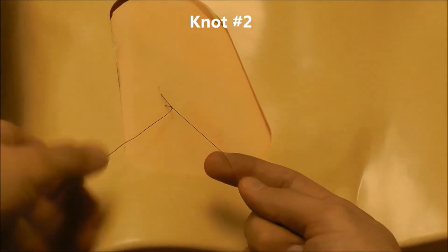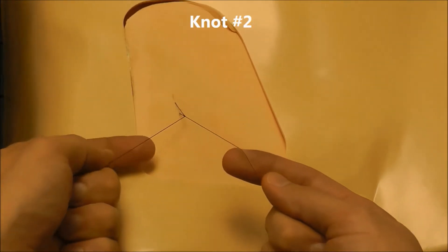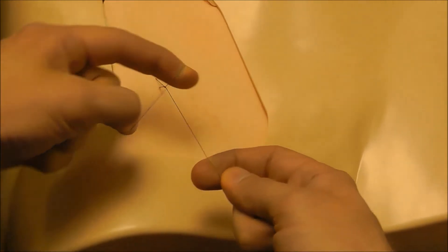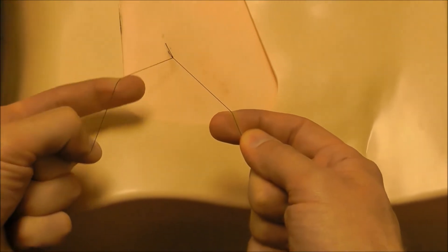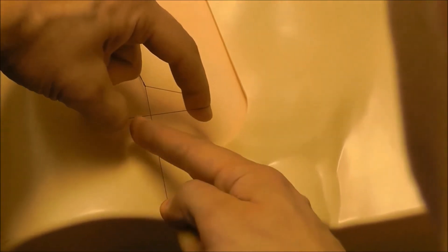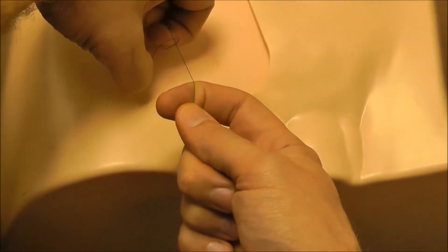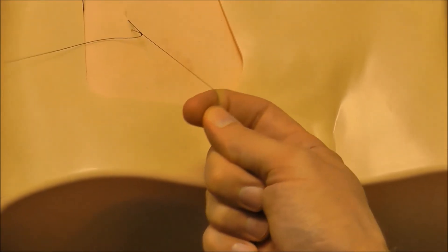The second type of knot that you need to know when doing a central line is this type of knot here. You take this line on the left and spread it out between the index finger and the thumb. Then you put that over on top of this line on the right. This portion on the left needs to come up underneath this loop — bring your index finger underneath and grab that line.